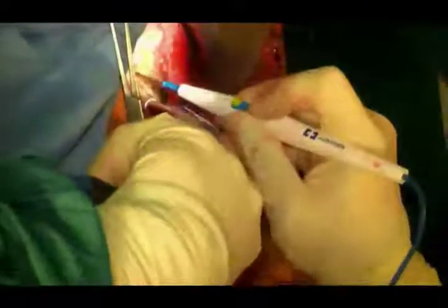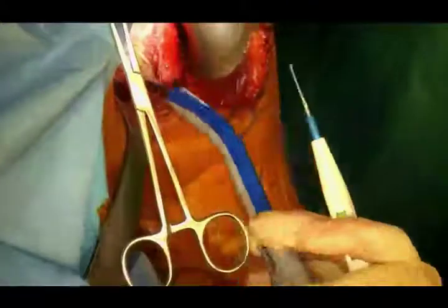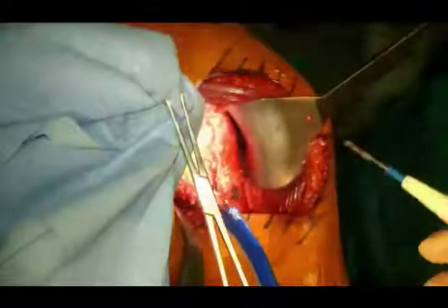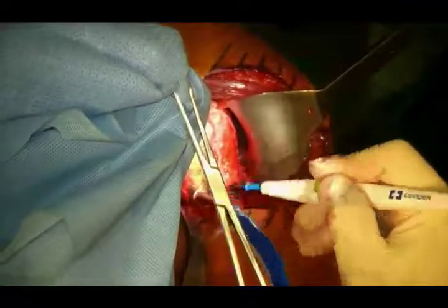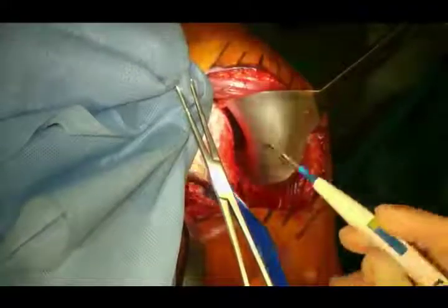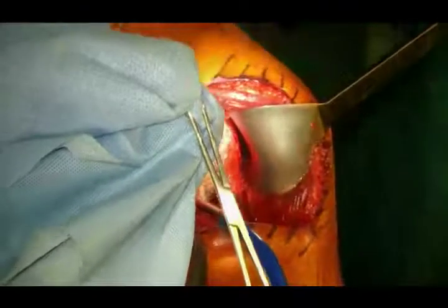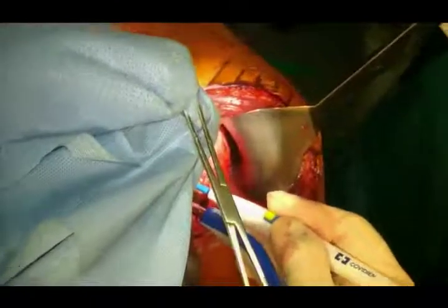I often use a suction device as a retractor — this is the In-Viewity, which is not just a suction device but also a light source. I have a headlamp on, but this gives me extra light. I'm a little paranoid about touching light handles above me — I think the less you touch them, the fewer contaminants you introduce.